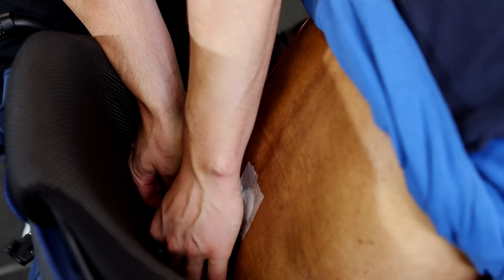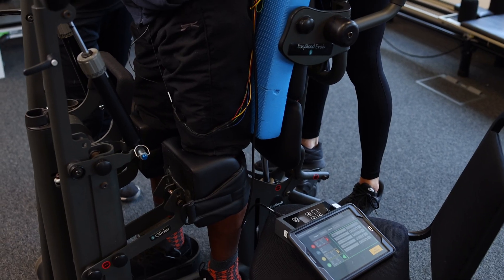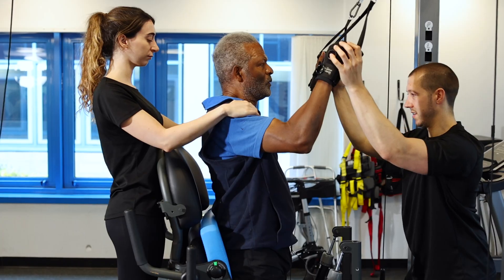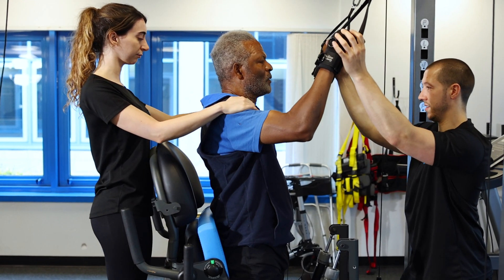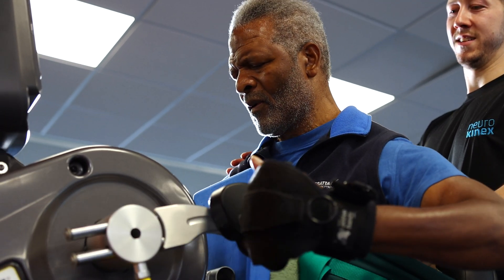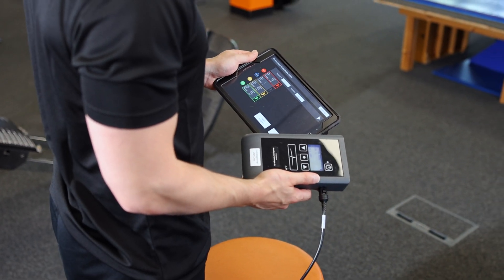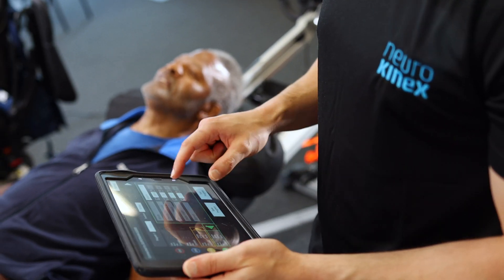Those spinal circuits are then more likely to respond when they receive impulses from the brain when we're trying to do a motor activity. It's really important that someone is taking part in an activity that's engaging and they're motivated to do. Transcutaneous spinal cord stimulation has been described a little bit like a hearing aid for the nervous system — it's enhancing the signals that the nervous system is receiving.